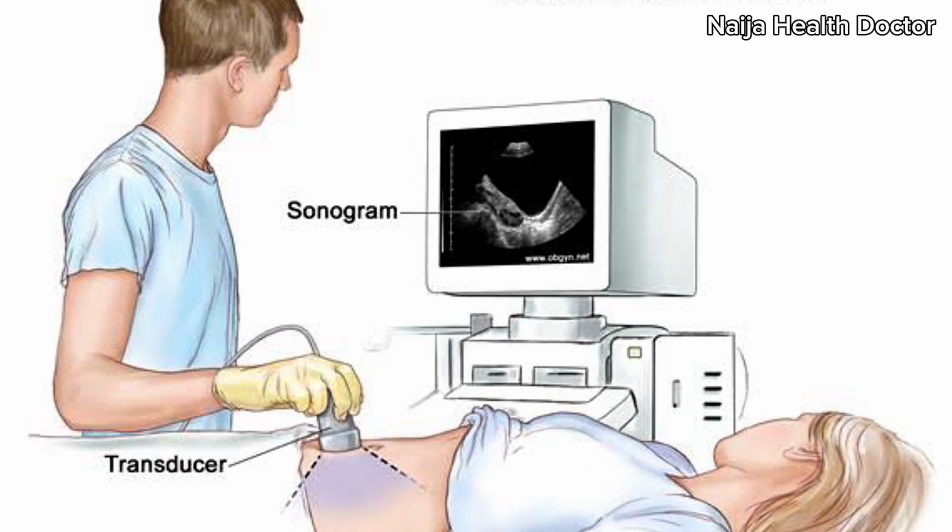Can you give us an insight of how ultrasound works? There's an ultrasound machine, then there's a transducer. So the transducer sends sound waves while placing the transducer on the patient's body. You know, there's like something that aids electrical conduction.